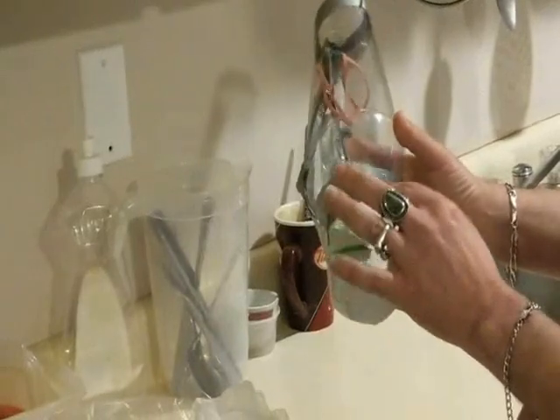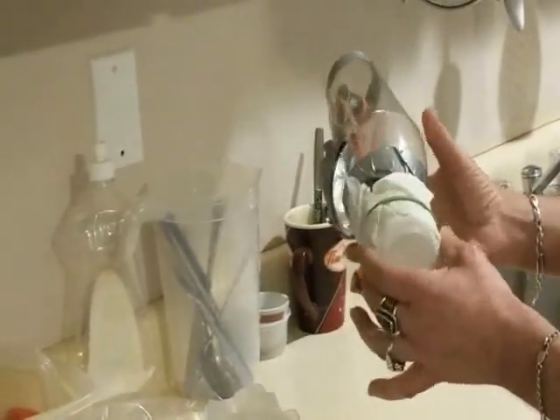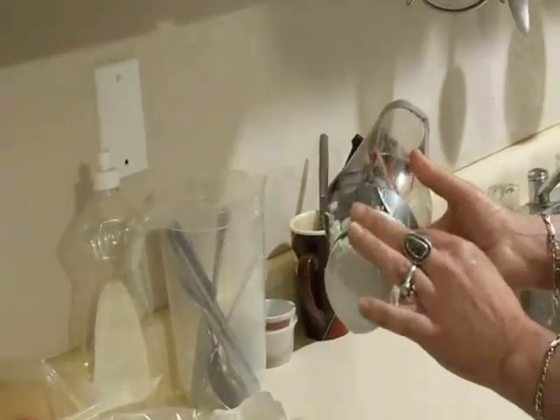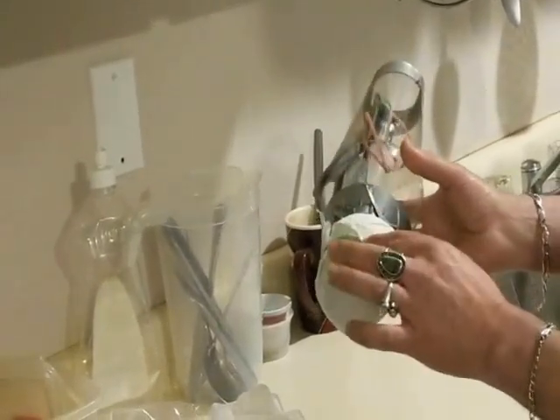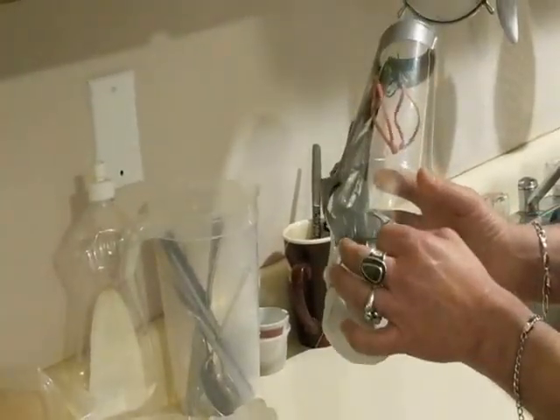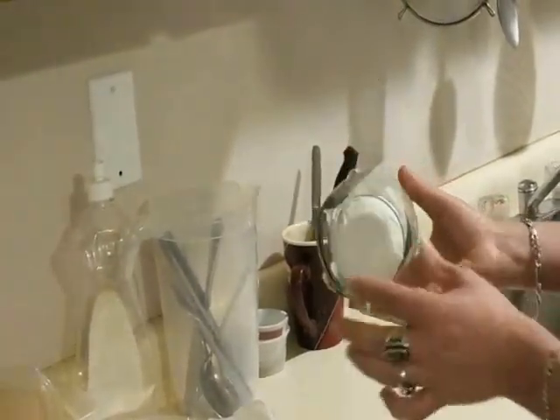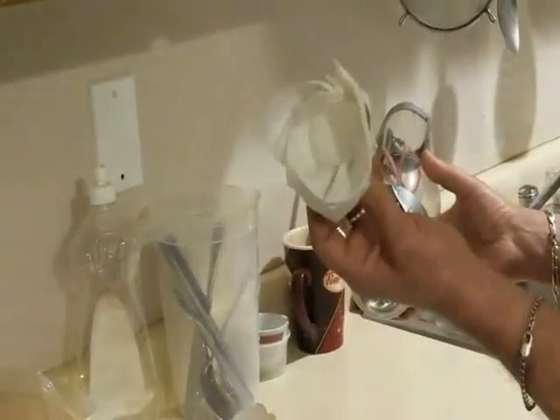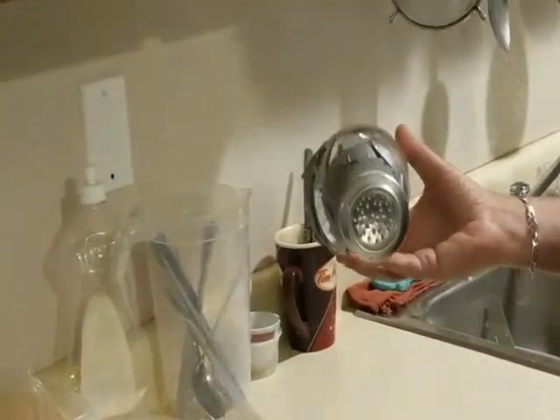So there's an elastic band, there's a tissue paper over top of that as an extra support, but you don't really need it. But if you want to, it's easy, quick release. Just remove the elastic band along with the tissue paper, and you can throw that into the garbage and replace it with another tissue paper on top of that with the elastic band.